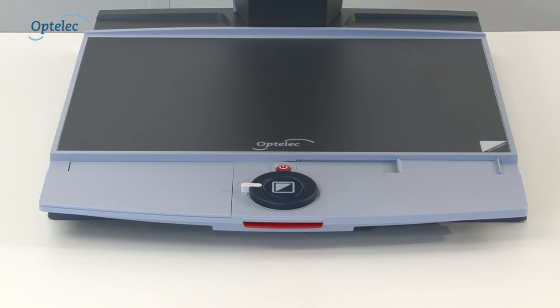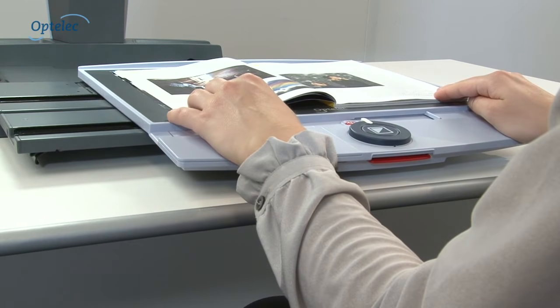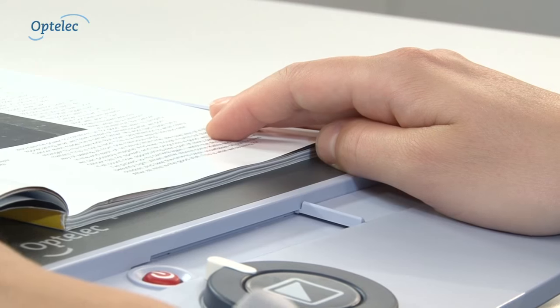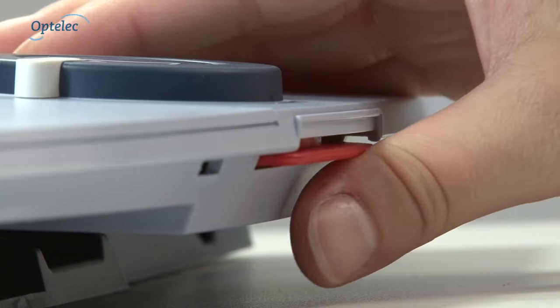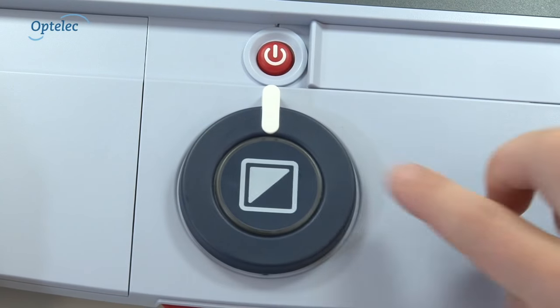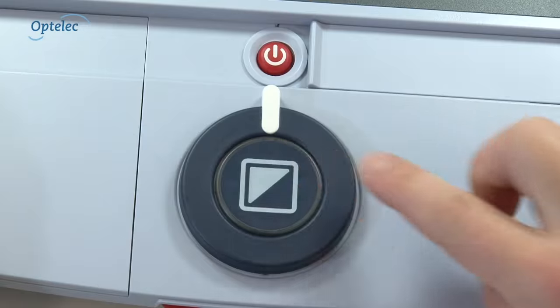The reading table makes continuous reading with the Clearview Plus much easier. The table moves smoothly in a horizontal line whilst the image stays stable and is clearly visible. The low and ergonomic reading table helps you read a continuous line of text at a time. To stop the table from moving, simply press the button at the front of the table. Buttons and controls are always located on the reading table, at your fingertips, for your convenience.